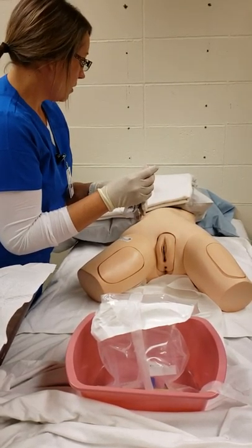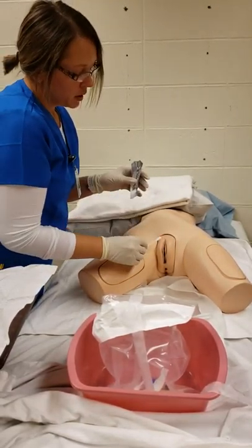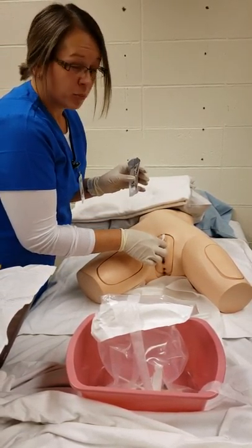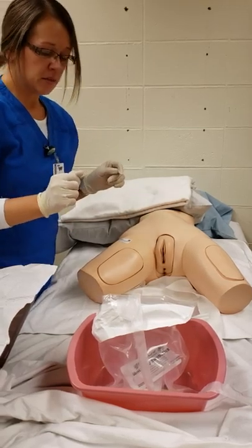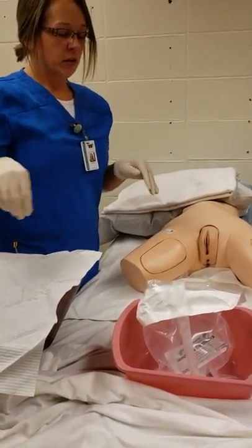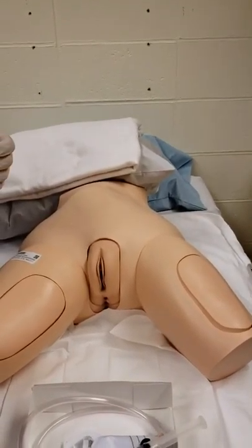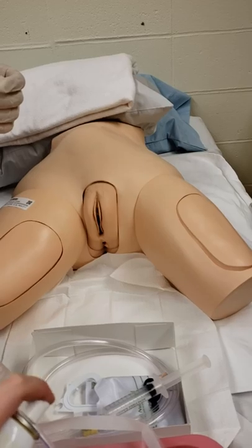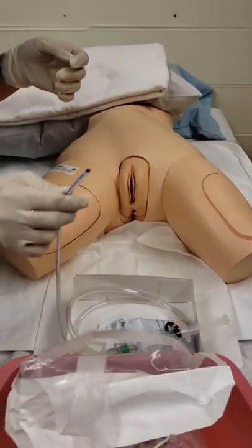I grab my swabs and I'm going to cleanse the labia area. Starting with the outer labia, discarding that swab, then the inner labia, discarding that swab, and then making sure to cleanse the urethral meatus — everything going from front to back. At this point I would normally have my lubrication in my tray. Since it's a female patient it would be two to three inches of lubrication; for a male it would be seven to nine inches.